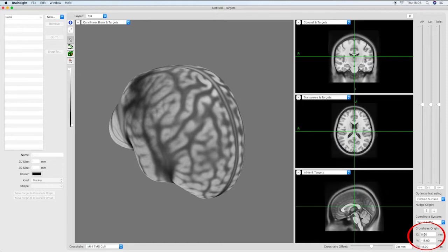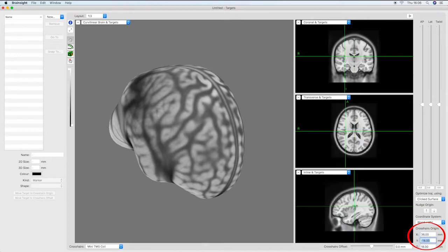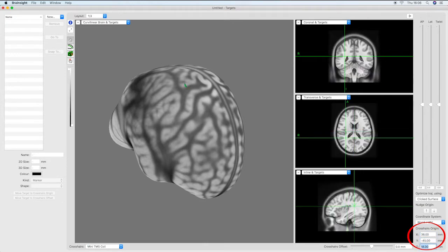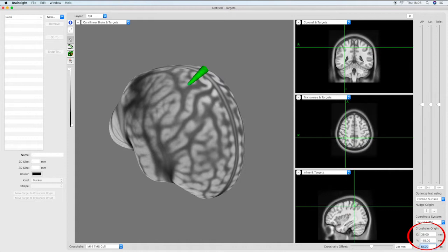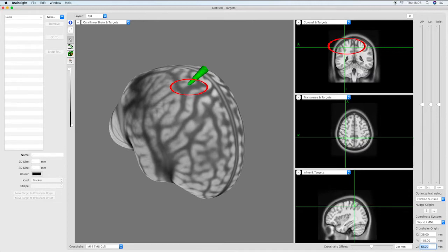Now we will proceed to input the coordinates. Here we have selected right superior parietal cortex as our site of stimulation. An example of an experiment that stimulates this site can be found in the video description. Once the coordinates have been entered you will notice that the crosshair has moved to the corresponding location in the 2D and 3D image views.